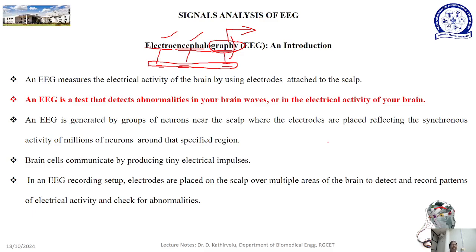We position the electrodes on the scalp using that protocol, and we use reference electrodes which are connected to the earlobes. We record the potentials across two adjacent electrodes on the scalp, which are connected to a differential amplifier, which gives the differential voltage between the two adjacent electrodes.